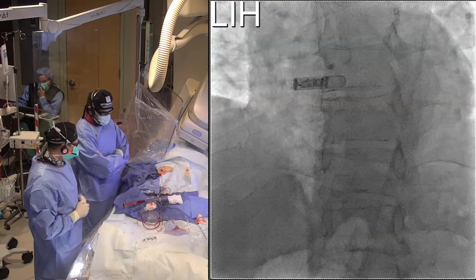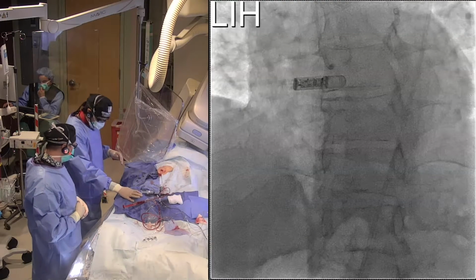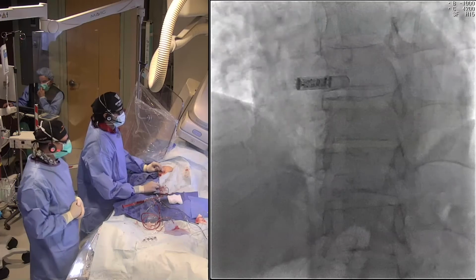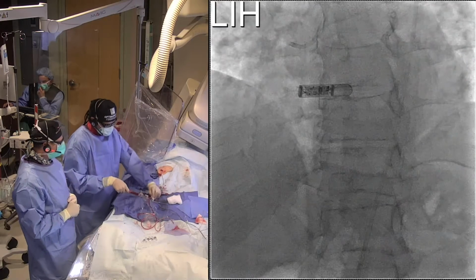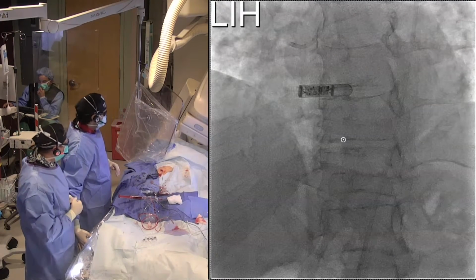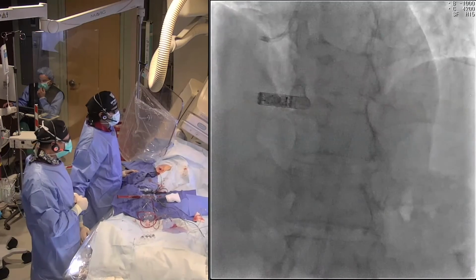But we're going to start with the right. I think the right has diffuse disease. One of the things I like to do when we do these assessments with iFR is not just a spot iFR, but also do a pullback and really understand the full physiologic map, if you will, of the vessel, to figure out which of the lesions need to be treated. Obviously in a diabetic like this, with all kinds of comorbidities, paving the vessel is not ideal.